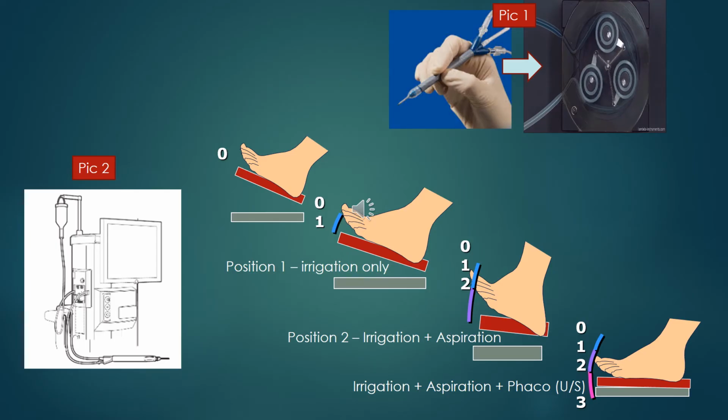Somewhat like how a snake has its food. What the snake does is contract, squeeze, and release. And that is how the snake swallows its food. To some extent, it is also what happens in a peristaltic pump here.